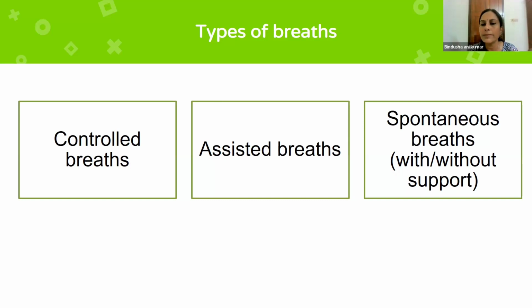And spontaneous breaths are the third type of breathing, where the patient will initiate the breath, and the patient is the one who determines how long to breathe. That is, inspiratory time is also determined by the patient, and tidal volume is also determined by the patient to a certain extent, but we will be able to give pressure support to increase the tidal volume. So these are the three different types of breath.